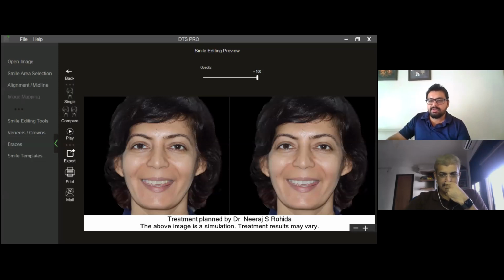One more very critical reason for developing this software was to get a software which is affordable by the majority of dental practitioners here in the country. There are similar platforms available at ten times the cost, which sometimes may not be the most feasible thing for an Indian scenario. So that was one of our primary goals.